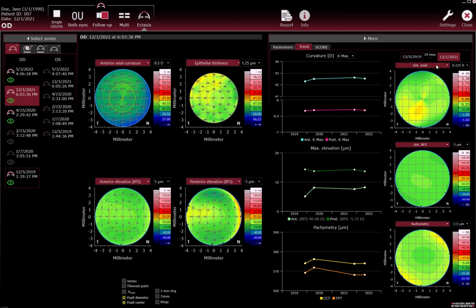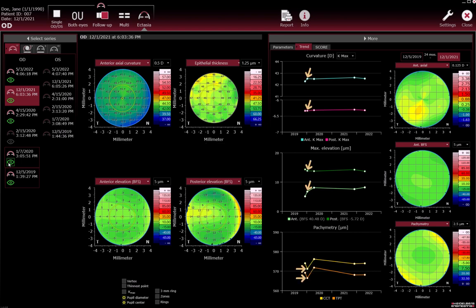To add an examination to the trend analysis graphs, click the black eye icon in the Select Series section — the button turns green indicating the examination is selected. To remove an examination from the trend analysis graphs, click the green eye icon — the button turns black indicating the examination is not included in the trend analysis graphs. For the curvature trend analysis graph, you can display the maximum or mean curvature by selecting K-max or K-mean from the drop-down list above the trend analysis graph.